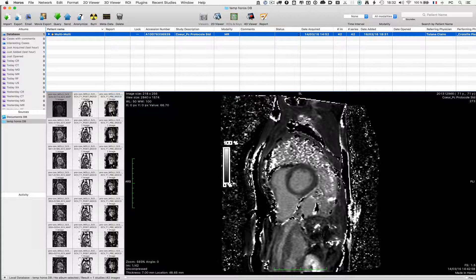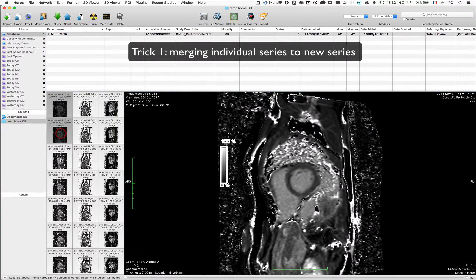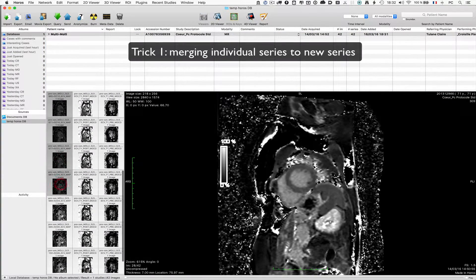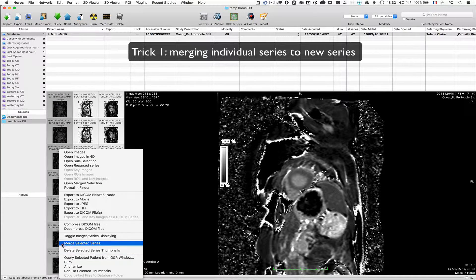I'll show you how you can avoid processing each individual image and instead process them as a stack of images. To do that, we will have to create a merge series by selecting the corresponding parametric maps. I am selecting right now all the ECV maps and I right-click on them and select Merge Selected Series.